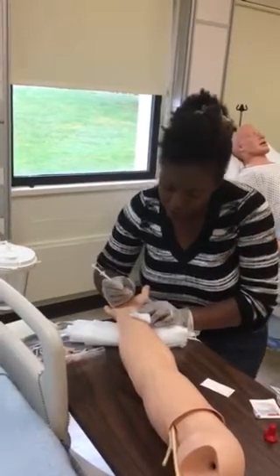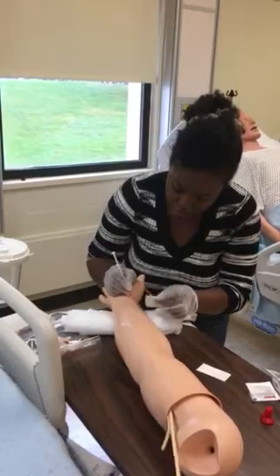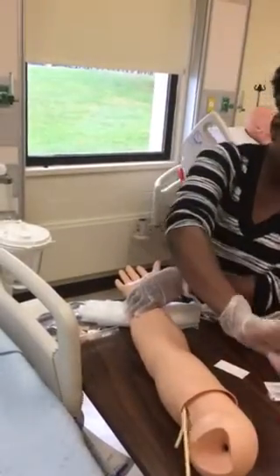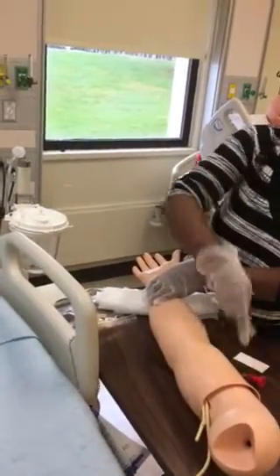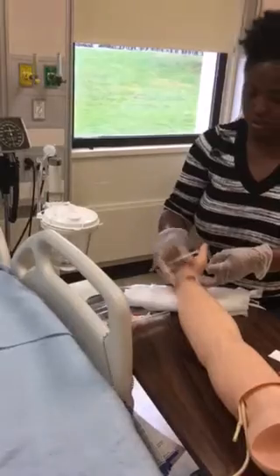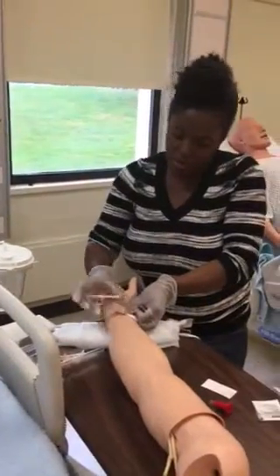Alright, Mr. John, you're gonna feel a little pinch. I want you to stay still, okay? Ready? And I will puncture. Cap my needle. I'll apply pressure for 3 minutes. Pressure band-aid on, keep applying pressure.